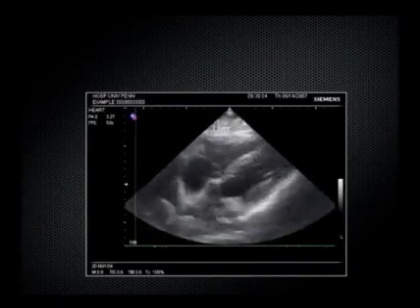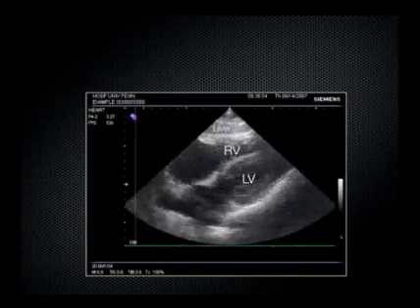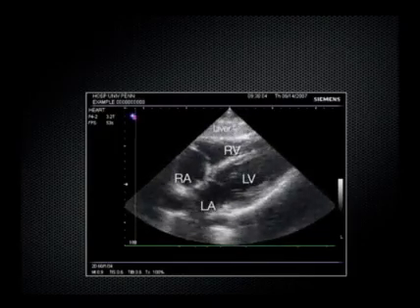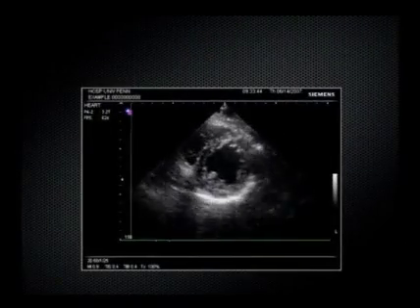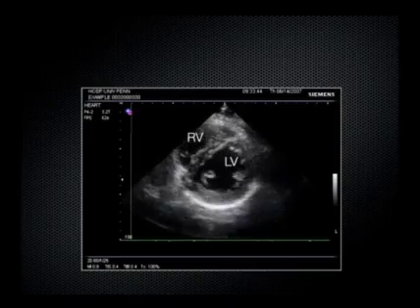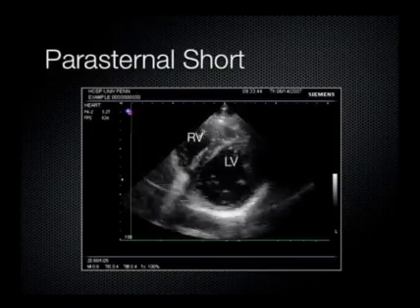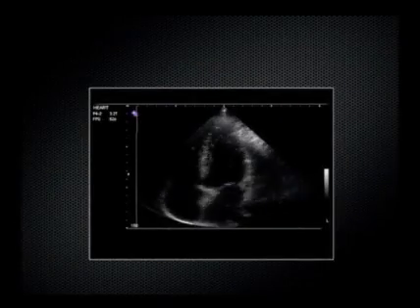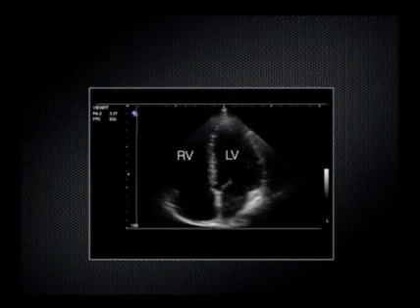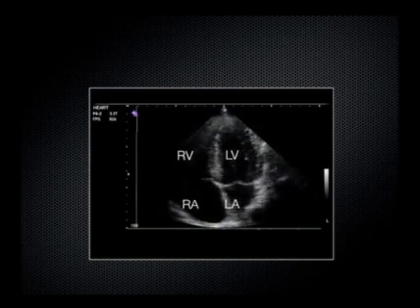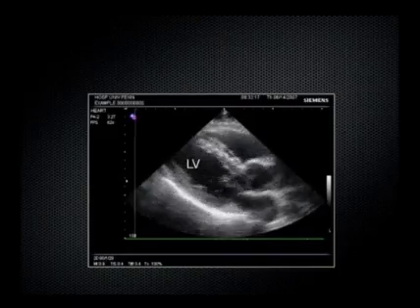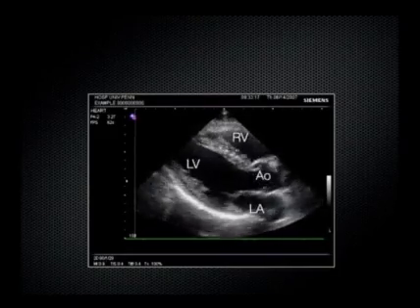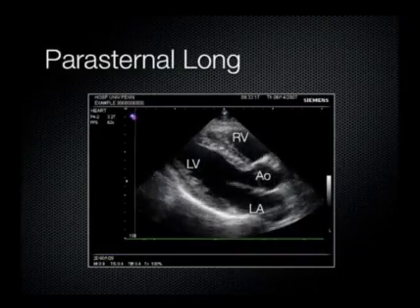For a review: here's the liver, the left ventricle, right ventricle, left atrium, and right atrium — this is the subcostal or subxiphoid view. Here's the left ventricle and the right ventricle in the parasternal short axis. We have the left ventricle, right ventricle, left atrium, and right atrium in the apical four-chamber view. And here's the left ventricle, right ventricle, left atrium, and the aortic valve outflow tract in the parasternal long axis.